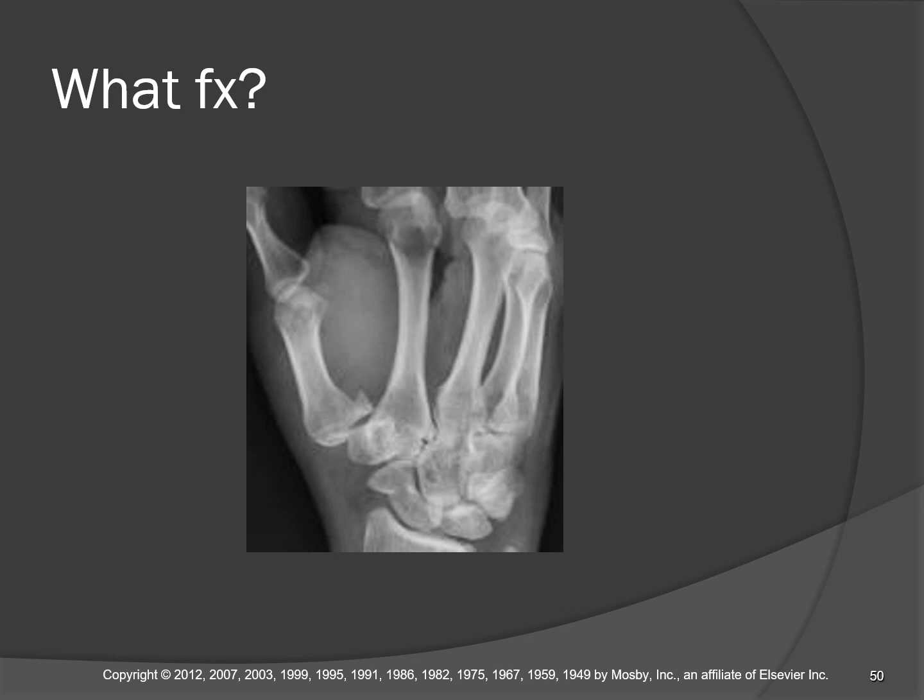What fracture here? This is an oblique hand, but it looks like there is a fracture to the base of the first metacarpal. So the question is, was that a boxer's or a Bennett's? It's a Bennett's fracture. That's right. Okay. The patient is rolled just a little bit too steep, but don't repeat it because we have evidence of a Bennett's fracture.